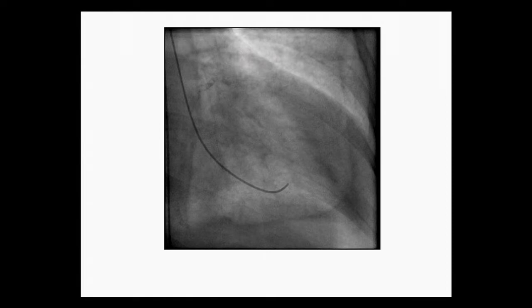This lady has sustained a recent hip fracture and needs surgery, otherwise she would not be able to walk. But she has critical CAD in two vessels, in her LAD as well as RCA, and LV dysfunction. The stress test showed only a fixed apical defect, but the patient has LV dysfunction. With all that, we did the angiogram, and clearly the first thing we wanted to do was ask the orthopedic team, and they said, yes, take her.